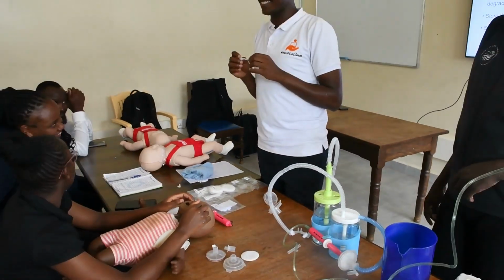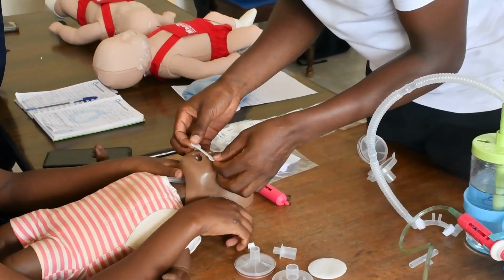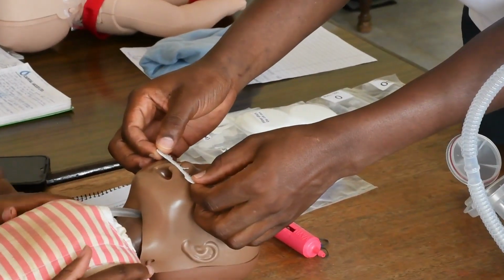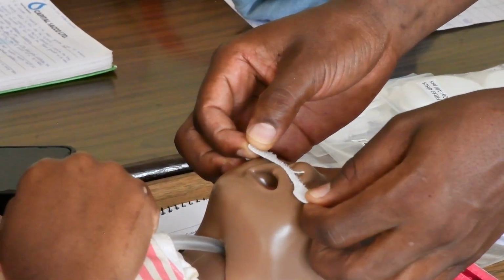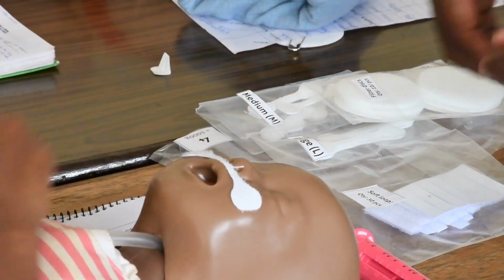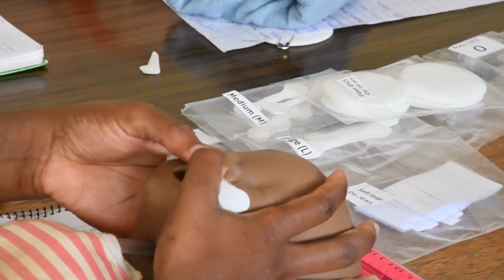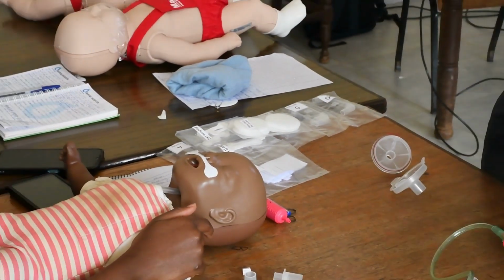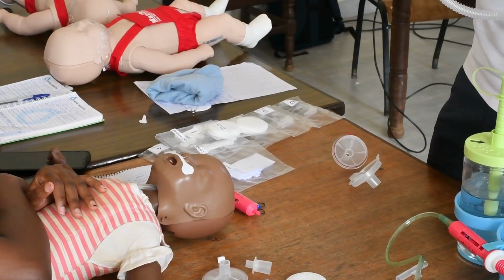After connecting it, you stick this to your patient. Make sure it fits there. That's it. So we need to put it on our patient. This is based on the size of your patient, right?